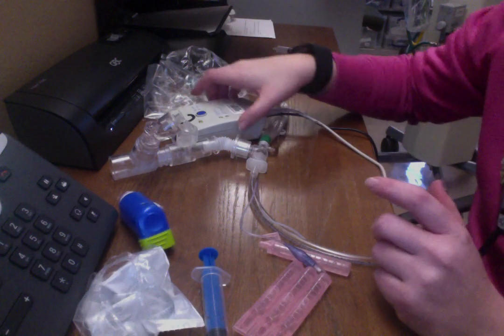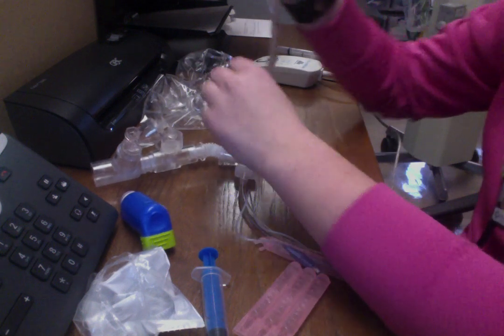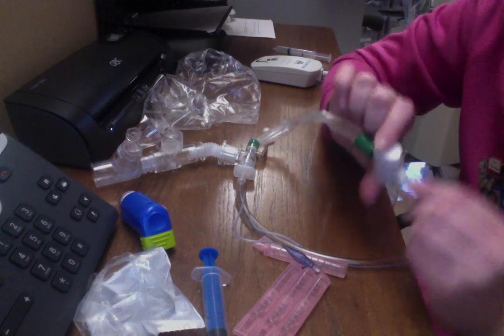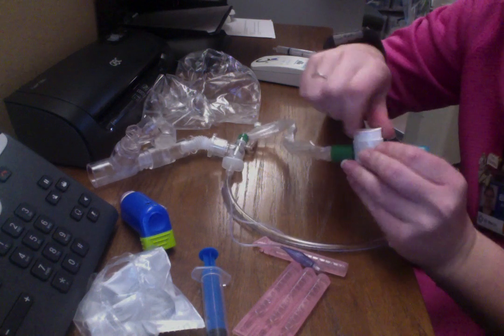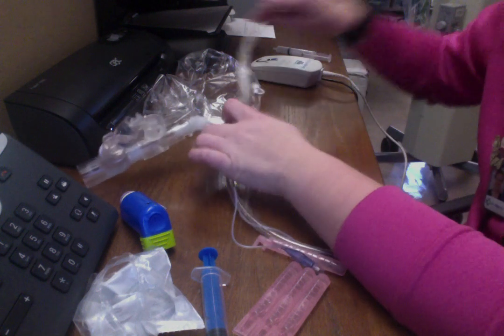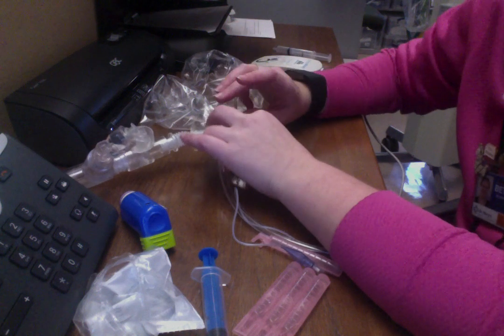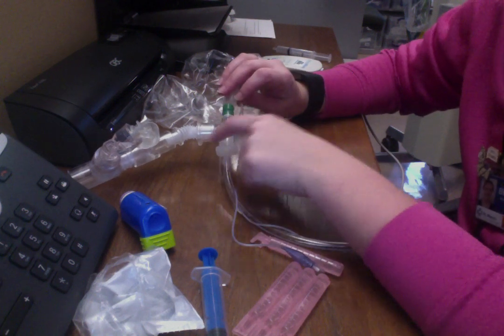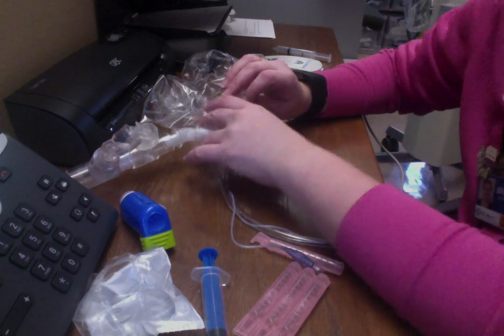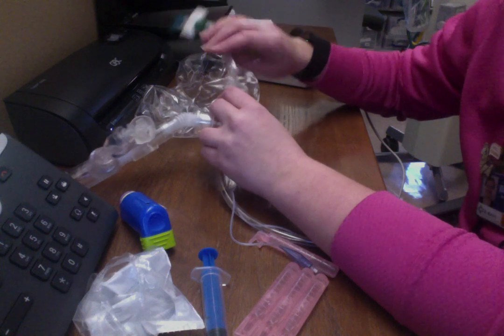The next thing I'm going to do is suction my patient. I would have this connected to my wall suction. I'd test it a few times, make sure that it is suctioning and not locked. You want to have a firm grip on the little Y here, so your ventilator that's coming in and the suction don't disconnect while you're suctioning. Then you just slowly slide the suction in.